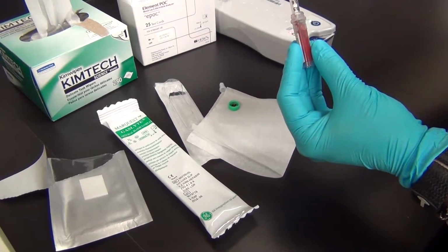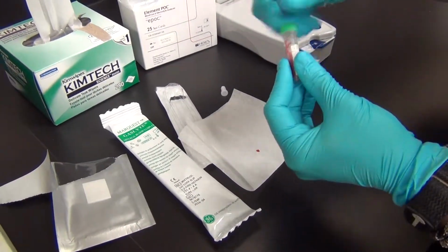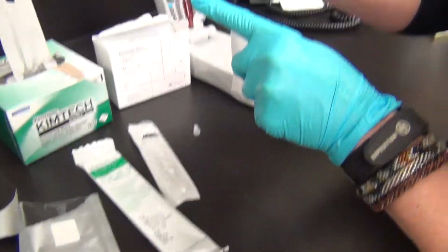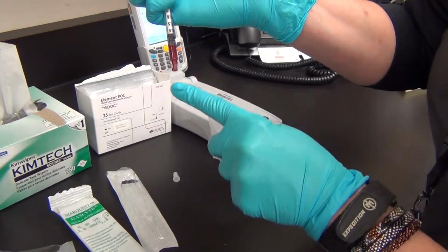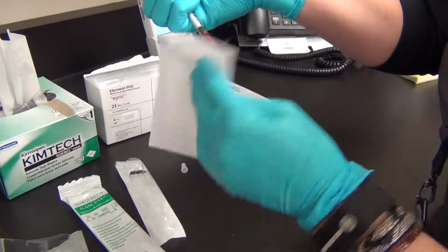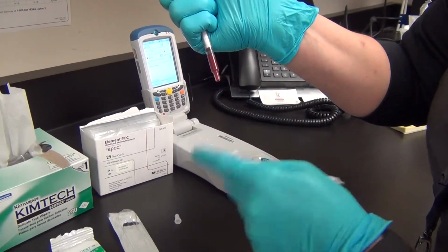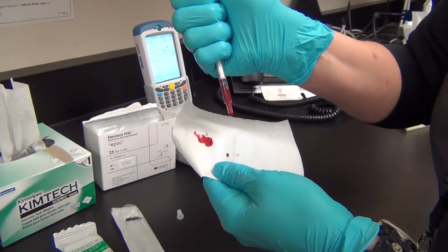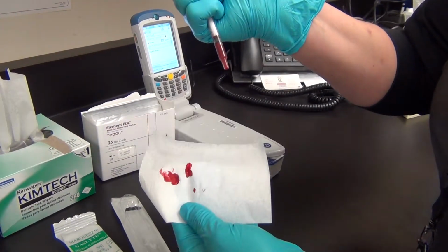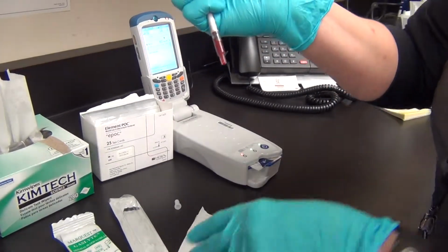have any large air bubbles in there. That's why I'm keeping the tip of the syringe pointed down. So we're avoiding large air bubbles. I have one small bubble. That's okay. That's not the part of the sample I will be injecting into the analyzer. So as the end of the sample here has been exposed to room air, I'm going to go ahead and create a drop and just whisk it away from the tip of the syringe without touching the chem wipe or lint-free wipe to the syringe itself.